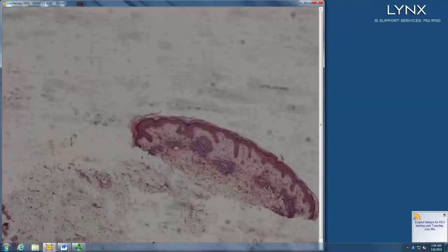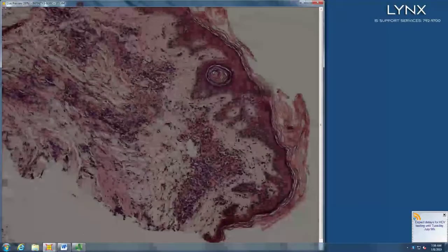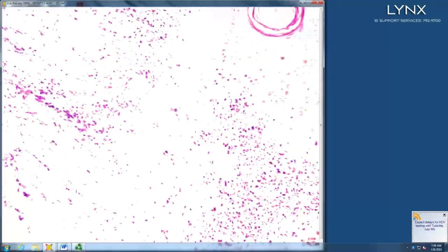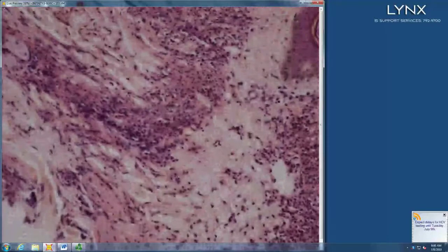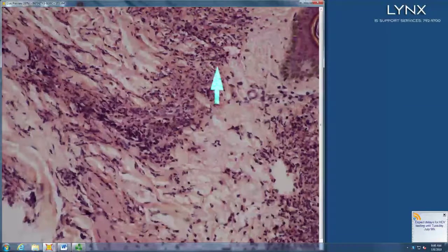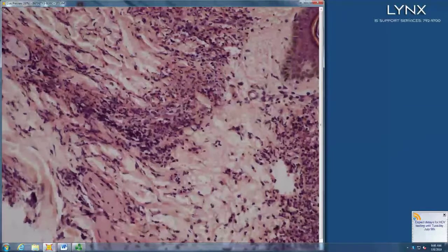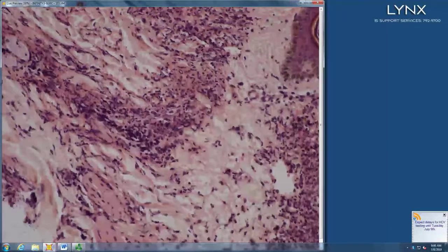So we have a superficial vascular infiltrate. Yep. And it's composed of neutrophils. Are all the ants intact, or are there ant heads rolling about? Ant heads rolling about, decapitated ants. Karyorrhexis. So there's karyorrhectic debris. So neutrophils, karyorrhexis, expansion of the vessel wall.